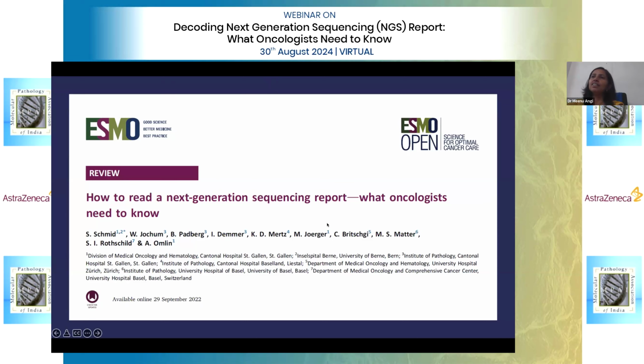So if it is covered in that, then only it will pick up. No, but Dr. Minu, that means you mean to say in that hotspot panel, 12 gene panel, I can hope that you will give me a TMB or MSI? Is that what you're saying? I don't think so. No.